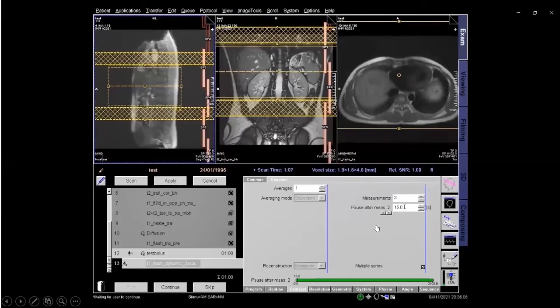Okay, so we know the CT scan, all of you will be very familiar with that. In the arterial phase, venous phase, portal venous phase, there are some delays. It's the same technique we are using. Once we have tracked the contrast, that is with the test bolus sequence, then immediately we'll start the scan here. Okay, so that will be the arterial phase.